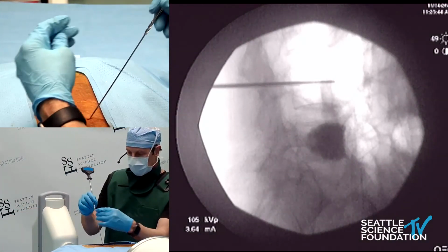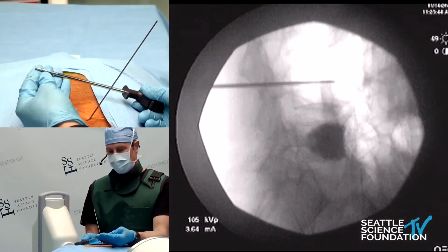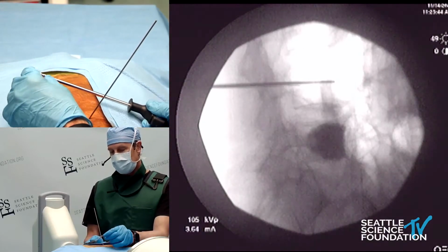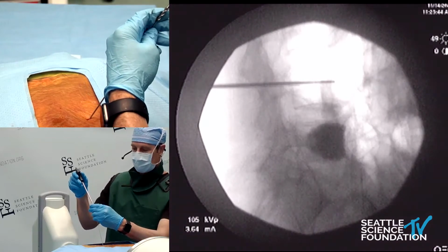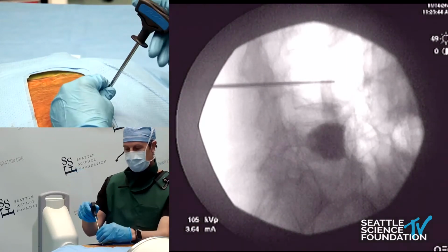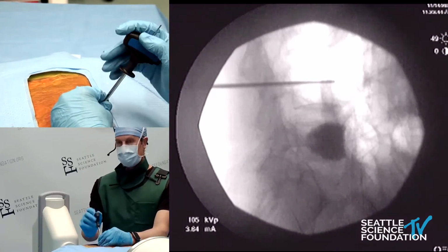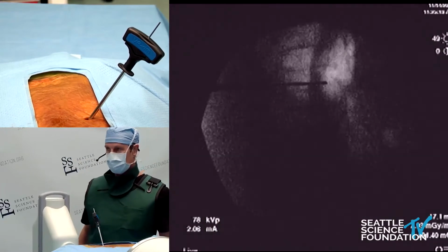So we want to make it big enough so the reamer goes through. The reamer is here, and it's not really a drill. It's shaped like a drill, but it's fluted, it's self-tapping, and it's sized appropriate. It's sized to the size of the implant, which the 5.0 means 5 millimeters. It will expand up to 17 millimeters tall. So as I put this in, I'll show you what it looks like on the fluoro.